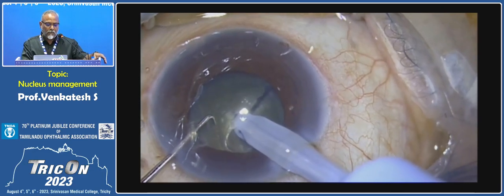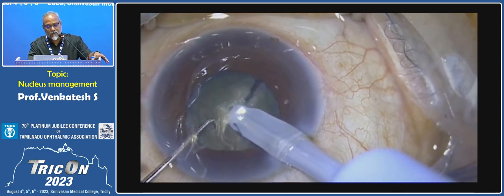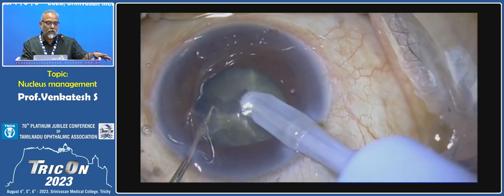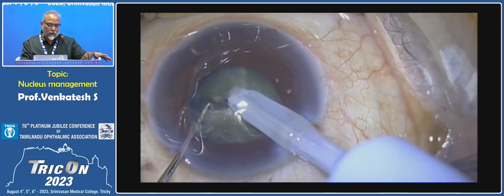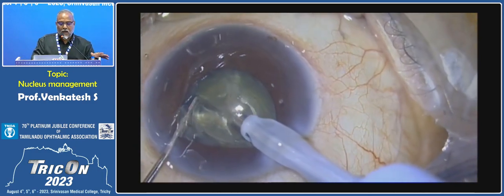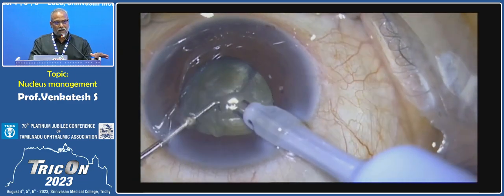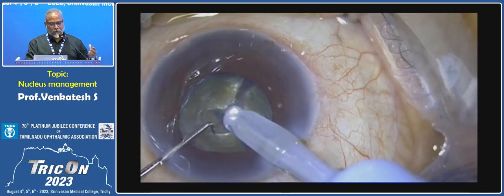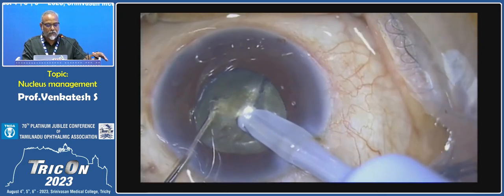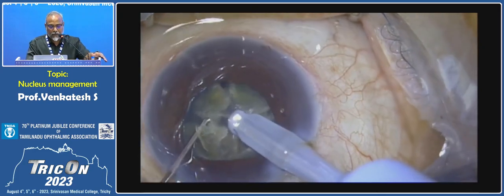So once you are able to lollipop the nucleus using a sufficient amount of power for that particular grade of lens, and if you use a sufficient amount of vacuum, say 300 to 400, 350 millimeters of mercury, once you hold it, you can use the sharp chopper to initiate the crack. Then going into the depth of this crack that you've just initiated with gentle lateral separation, you can create the separation and creation of fragments.